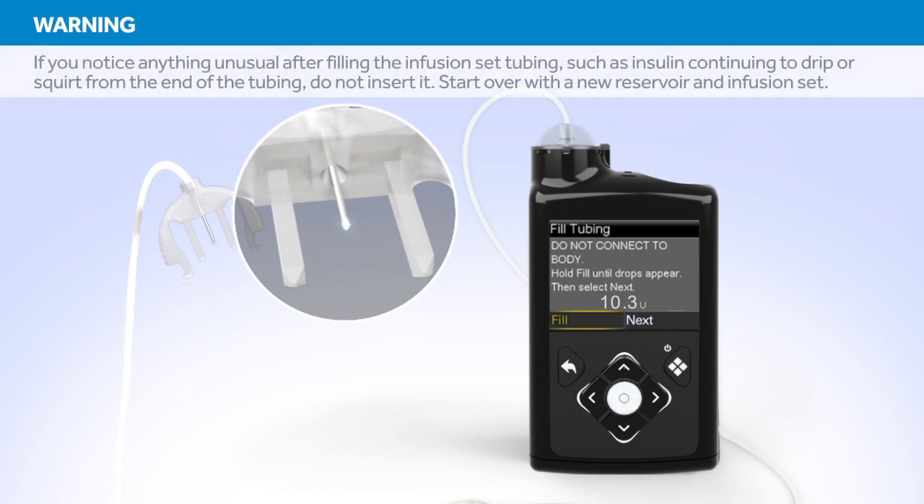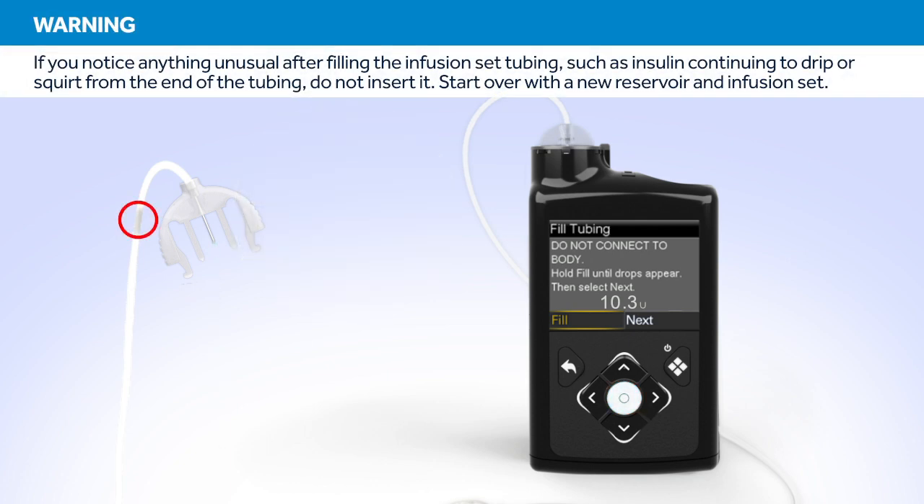Hold up the tubing to the light to check for air in the tubing. If you see air, once again press and hold Select until the air exits the end of the tubing. Now press Right and select Next.